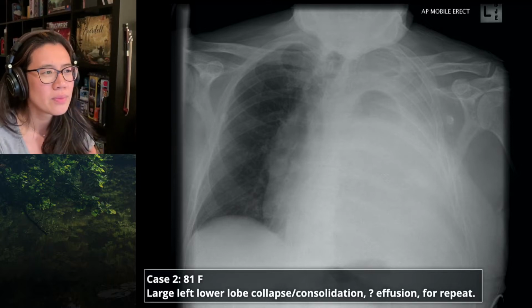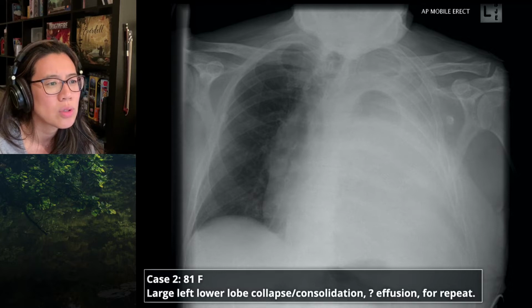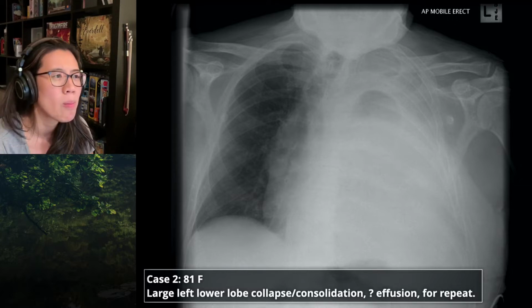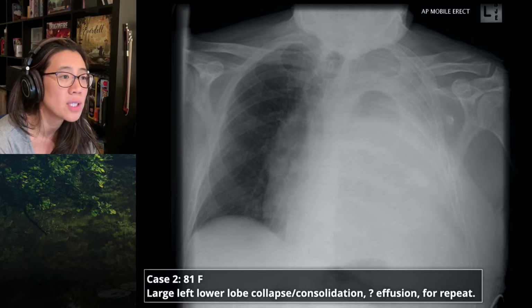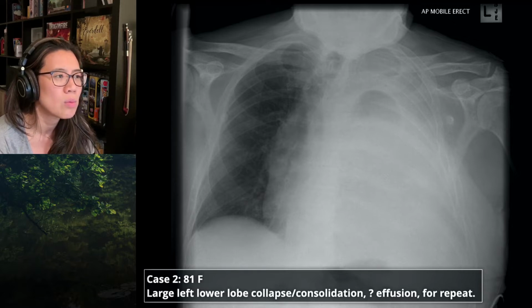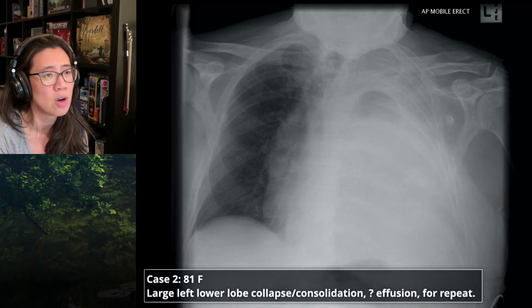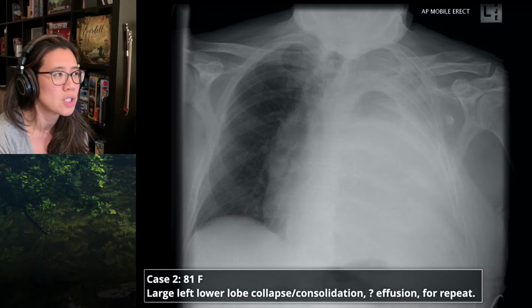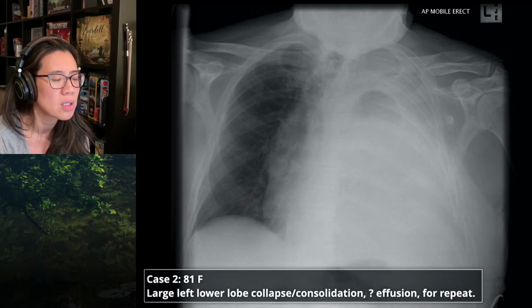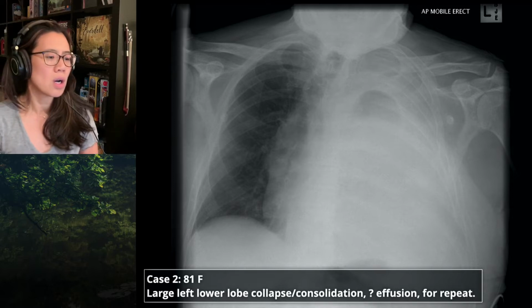Given that you've noticed it, I'll tell you, she came in 3 days ago, having fallen on the left side. Okay, now that you say that, I think there are rib fractures on the left. And there are rib fractures, and both lungs looked normal 3 days ago. So, in the context of trauma, we've got increased opacity with mediastinal shift. So I'd be concerned about a growing effusion, growing hemothorax. I'd want to know if she's clinically unwell, though she doesn't have any oxygenation tubing. It's the typical old trauma patient admitted to the medical wards: they did an X-ray follow-up, saw it looked abnormal, so they did what they usually do. They did another X-ray. So I don't think anyone's actually looked at her to see how well she is.